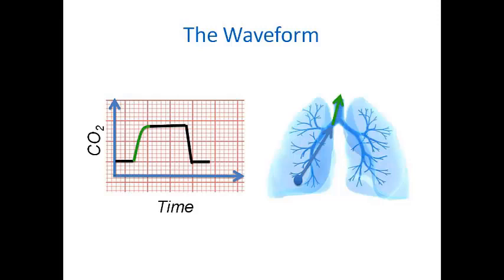As the movement of the wave goes upward, we're starting to measure both the dead space, and as we come closer to the plateau, we're measuring a mix of dead space gases, larger airways, and the beginning of the alveolar gases. The plateau is going to measure the hold of end-tidal CO2 values that have CO2 directly from the alveoli.